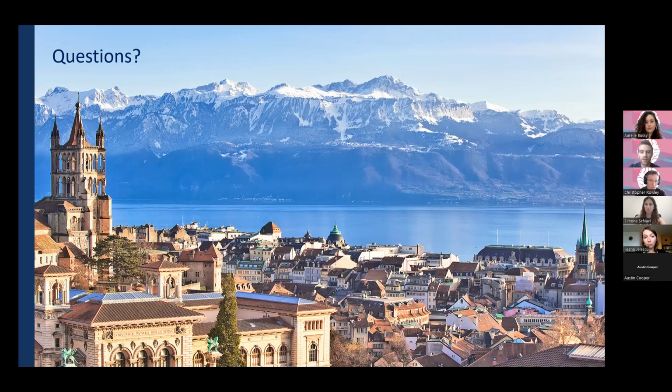Perfect, thanks. Another question in the chat by Matthew Hoffman. So by clinical scanners, do you include something like a Trio? Yes, I do. So of course, you will be even more limited because the gradients, for example, are half what they are on the Prisma, right? So you're going from 80 millitesla per meter to 40 millitesla per meter.